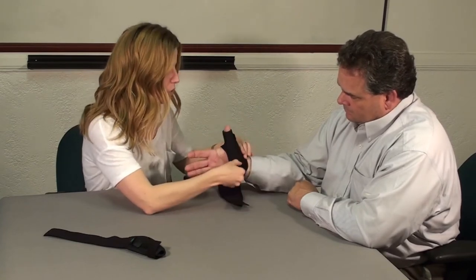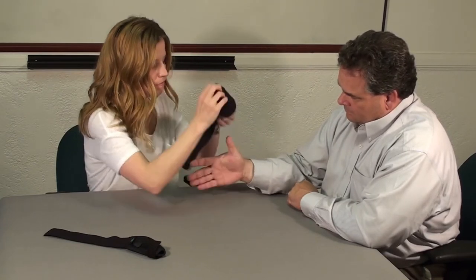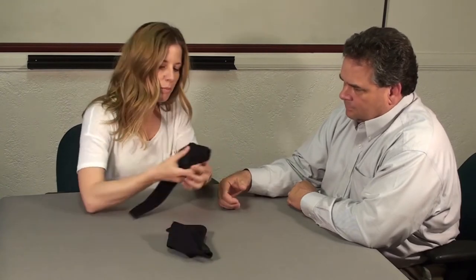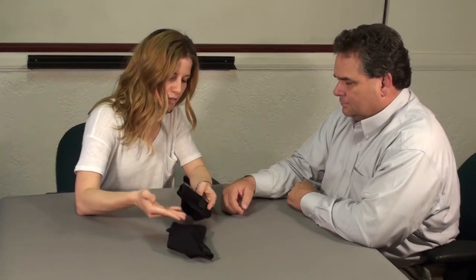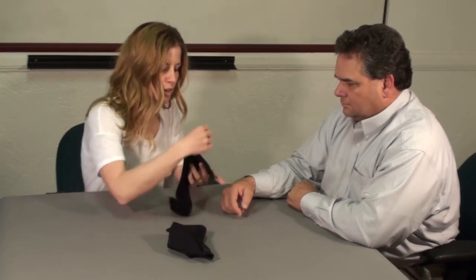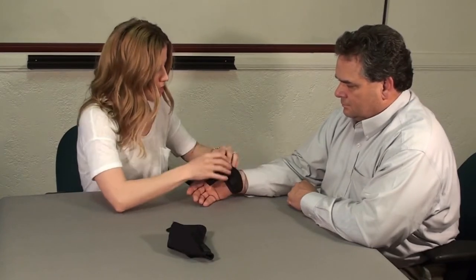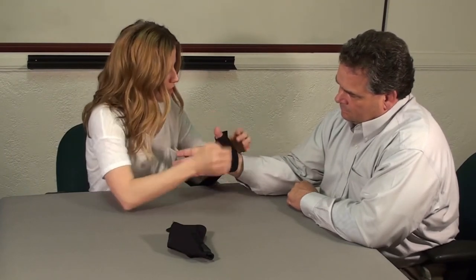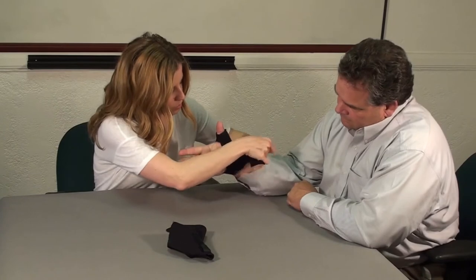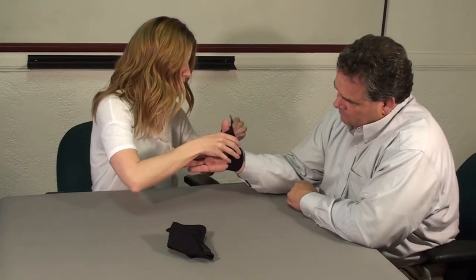The next one is what we call the Santa Barbara thumb — a little different design. You'll notice three stay pods instead of just one single stay pod. Slip your thumb in there. I'm going to tighten around your IP. You can trim that strap, and then same as the other one — you just catch the velcro there, wrap it around.